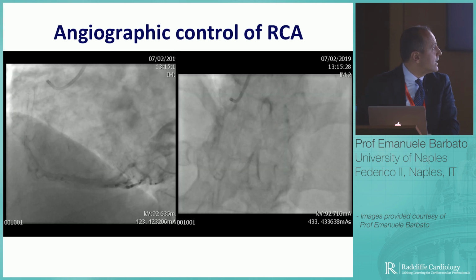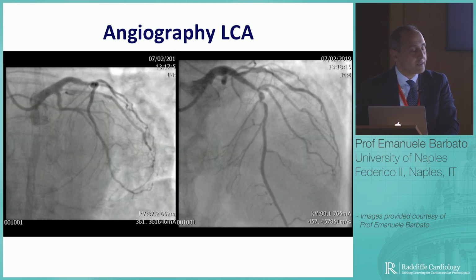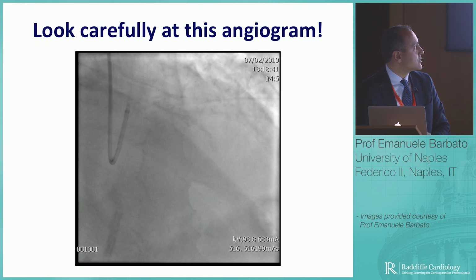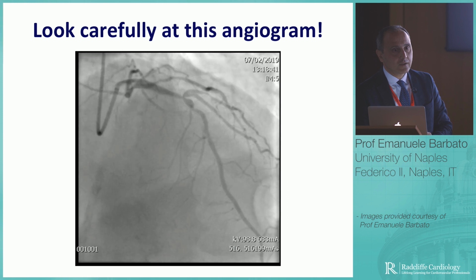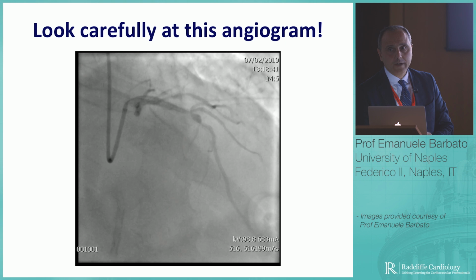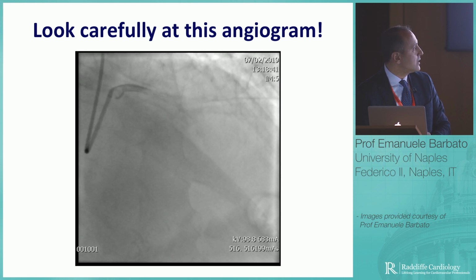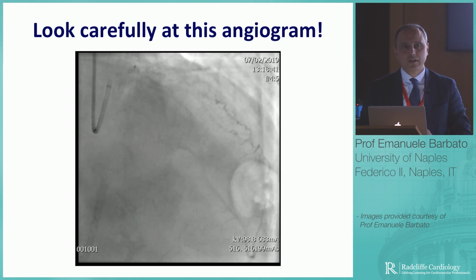And this is now the angiogram taken with the guiding catheter. It is a little bit better filled. So you see again the lesion there. And please look carefully at this angiogram. Perhaps you can better appreciate the amount of calcium now, the length of the lesion, from where to where to do our treatment, the additional challenge of the bifurcation just in our way. Let me ask you again, who would do some plaque modification first, having seen this?